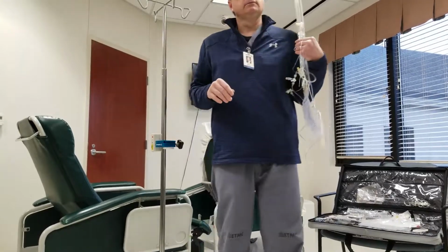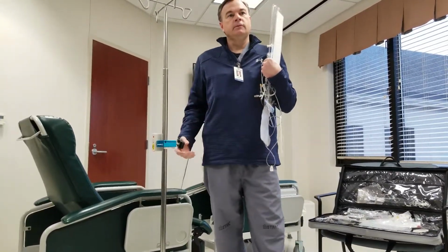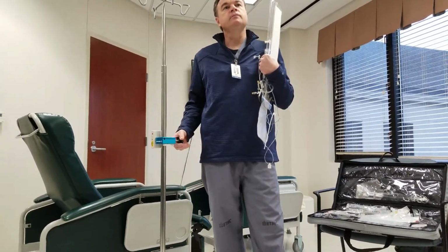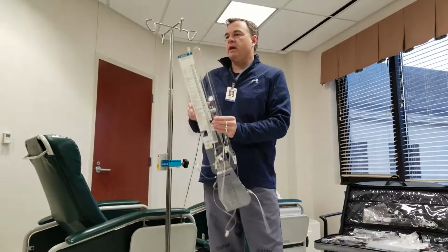So your IV pole, you guys, won't be at the head of the bed like you normally think it would. It's typically going to be coming out right at your waist, about a quarter of the bed down. Right.